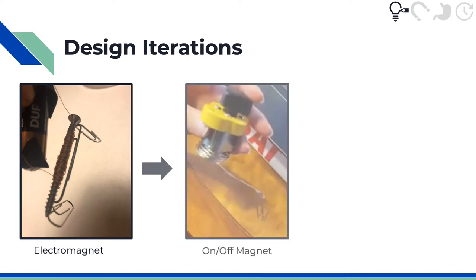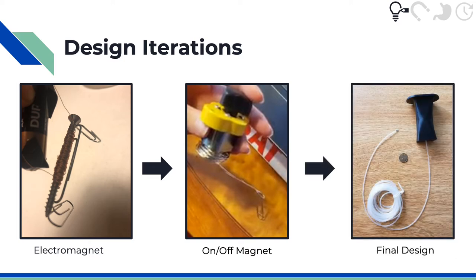We then tried an on-off magnet that had a long wire connecting it to the end, but we found that the wire didn't transfer the magnetism very well, so it could only go a short distance. Thirdly, we tried our current design, which has a catch and release mechanism with permanent magnets in order to reposition.